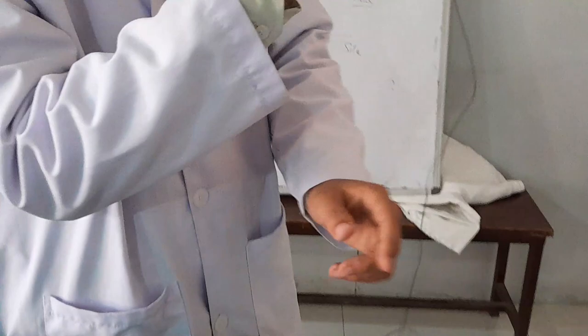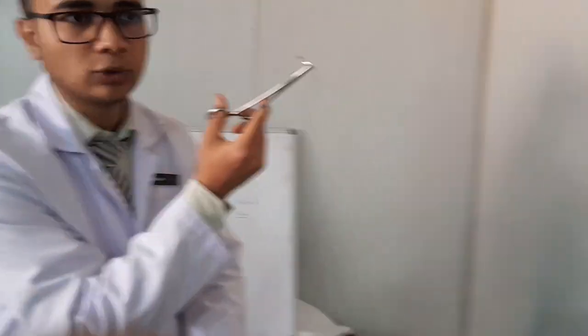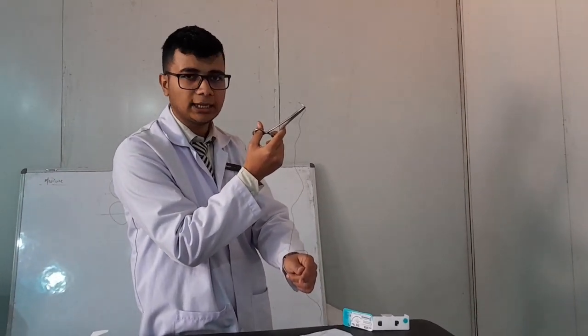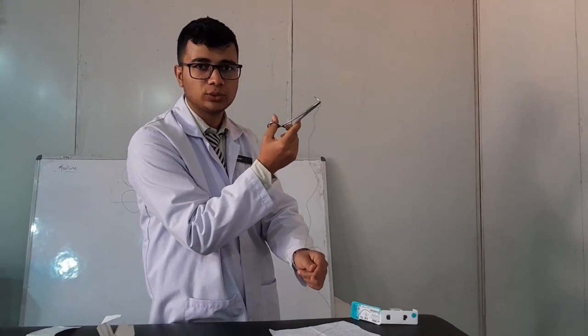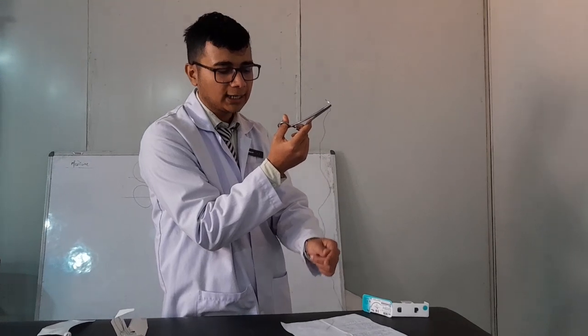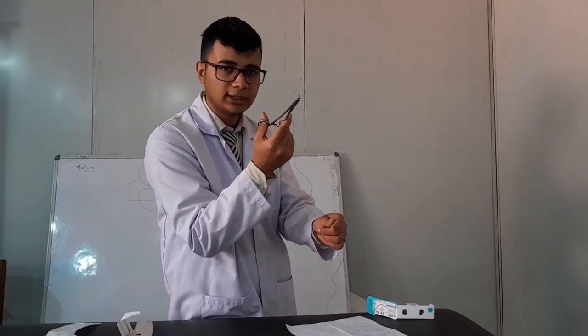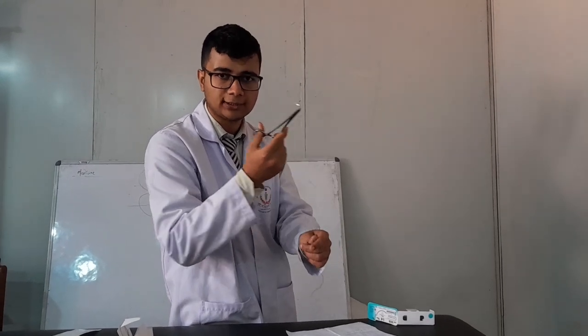And I have already told you, this is multi-filament, so it does not recoil back, it does not have any memory. And since it is multi-filament, bacterial growth can occur in it, so we have to be cautious about whether there is a chance of infection or not. And since it is multi-filament, it will have better handling, so there can be fewer knots than with the monofilament. You need to keep that in mind.